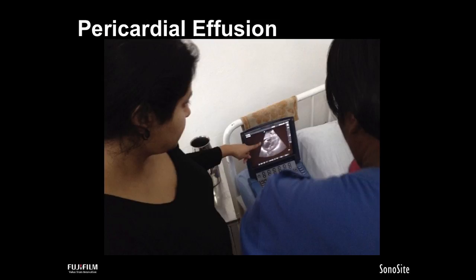The next part of the cardiac portion of the cardiopulmonary ultrasound protocol is to look for an effusion. Blavis published a study in Academic Emergency Medicine in 2011 looking at 113 patients with undifferentiated dyspnea who underwent a focused cardiac ultrasound, and he found that 14% of the patients had pericardial effusions, 4 of which were classified as large. We recently published a similarly designed study of this CPUS protocol that I'm describing here today in Critical Ultrasound Journal, just published this month actually, and its performance in Haiti.